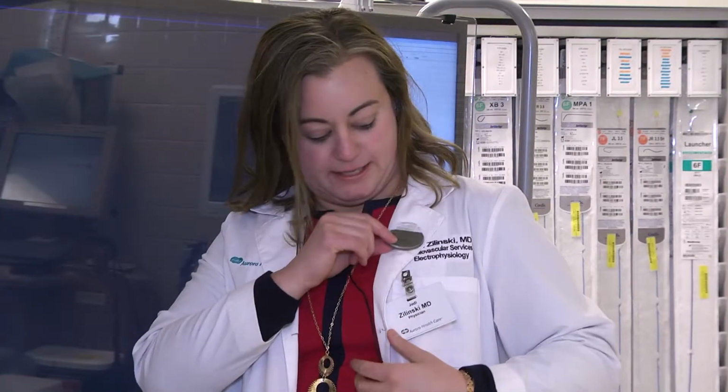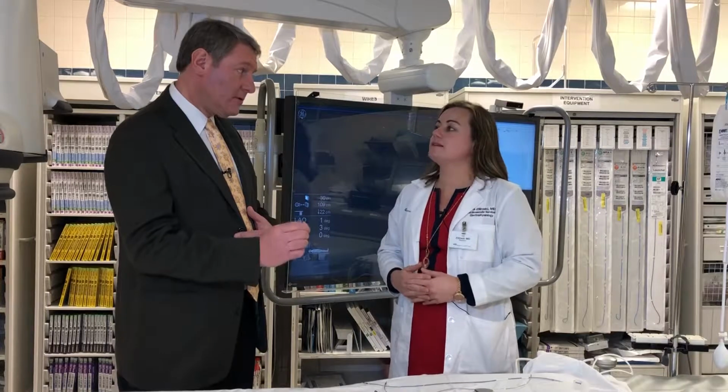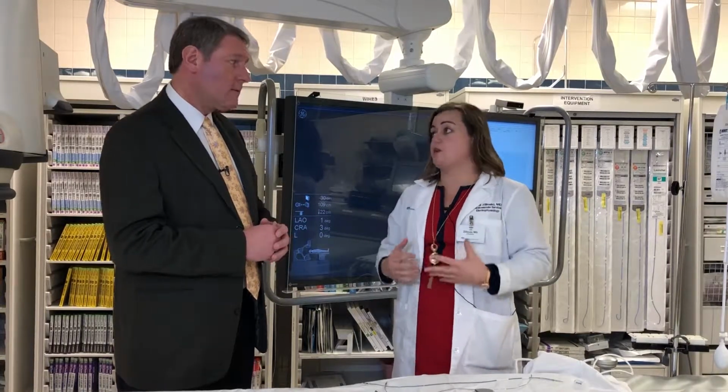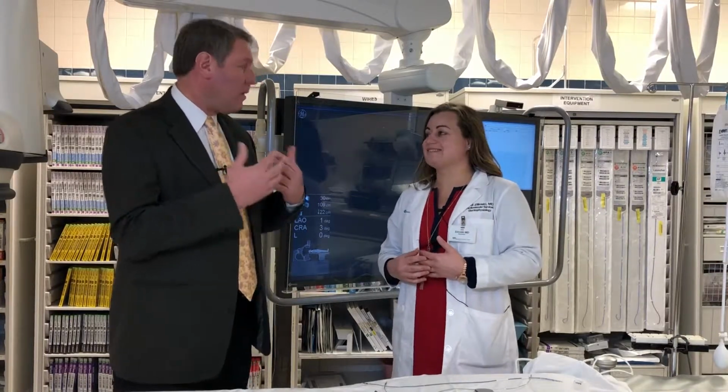Okay, and where would that be placed in our body then? So the pulse generator tends to sit right here under the collarbone, up here in the shoulder, under the skin. Depending on a person's size, usually you don't see it at all, just a little scar. Sometimes if you're a little thinner, it might stick out a little bit of a bulge there. Okay, and again, when is the pacemaker used? Pacemaker's used when someone has a slow heartbeat. Because essentially if someone's heart's beating too slow and they feel lightheaded or fatigued, or even if they were to pass out because of a slow heart rate, that might be a time when we would put in a pacemaker.